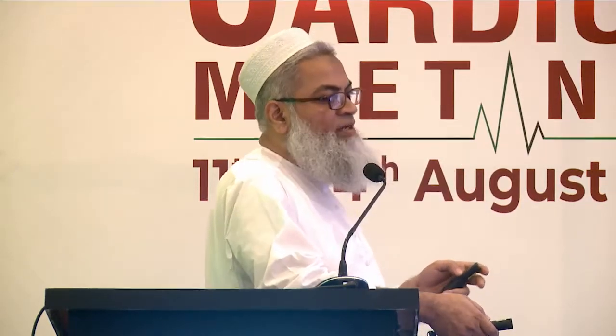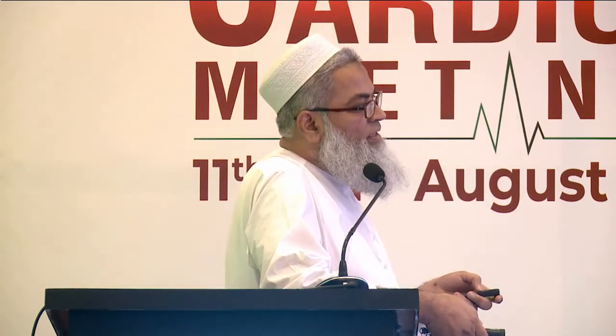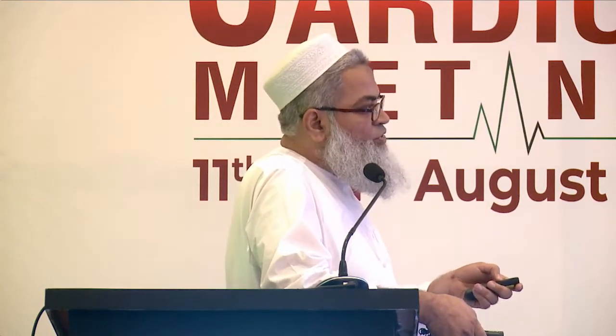Basically, when you are puncturing, you punctured the septum and your needle was directed at 6 o'clock, 5 o'clock. But your mitral valve is towards you. So you want to rotate the system again to 3 o'clock. From 5 o'clock to 3 o'clock means you want to rotate anti-clock. When you rotate anti-clock, there will be more chances that you will cross the mitral valve easily. Then you come back to your working image, which is usually RAO 30.